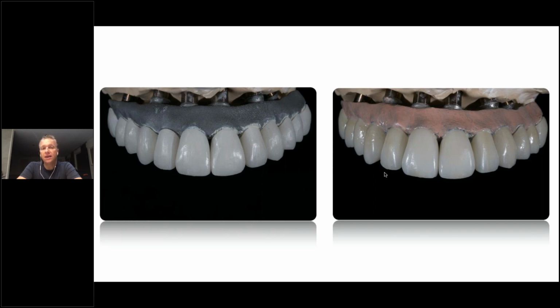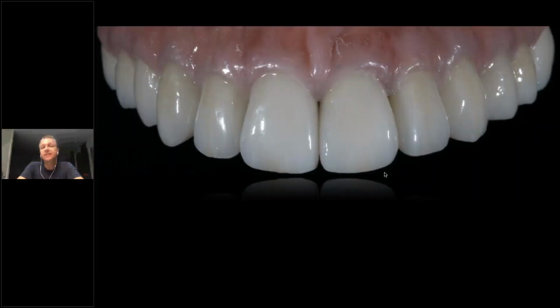Here in the middle of the making, teeth are just polished, not glazed yet, but I'm already preparing the metal with opaquing. On the right side, we see the glazed teeth, and I put some pink on there. I think they're already cemented. I cemented teeth on that metal frame. We also could use a polymer like a PEEK, and I can then finish up that restoration with composite in the gingiva, and the ceramic is glazed and done and polished.